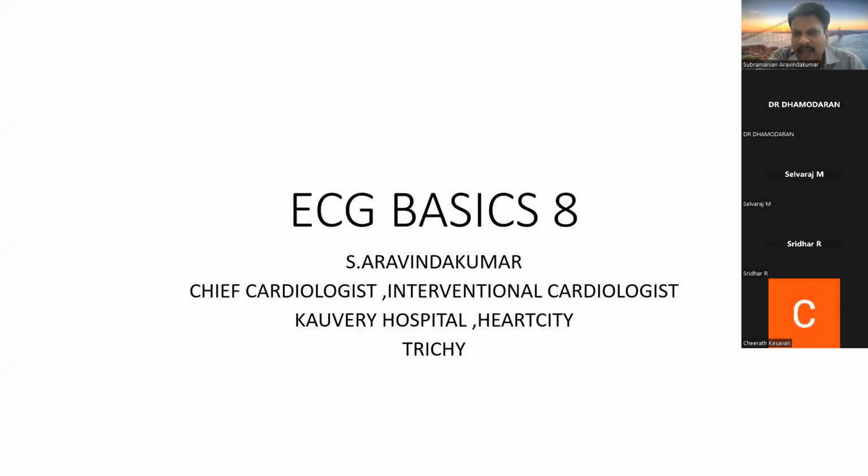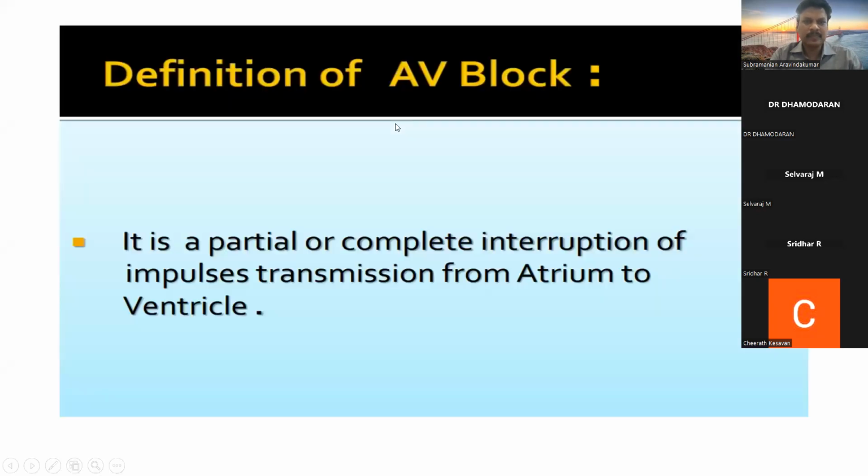Good evening, friends. Once again, coming back to the ECG basics, the eighth session of the ECG basics, and today we will be talking about atrioventricular block. We commonly call it a complete heart block.